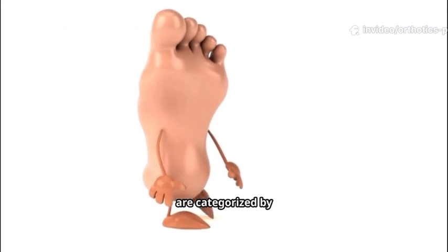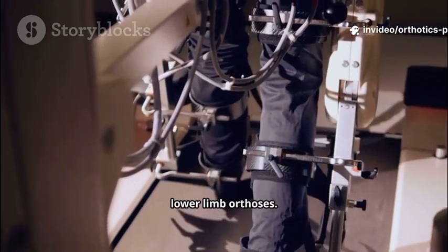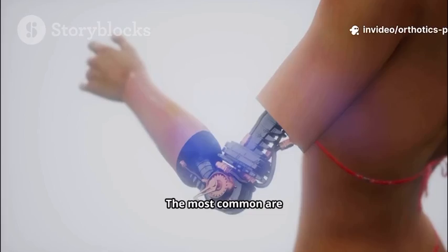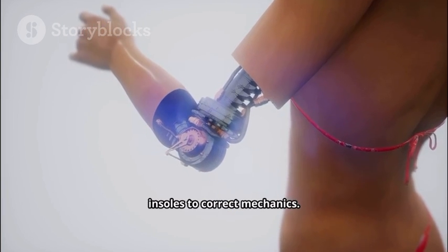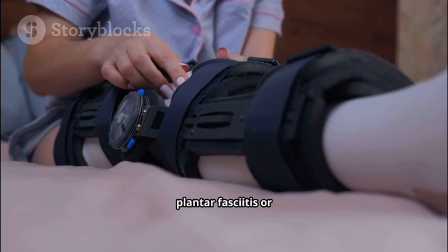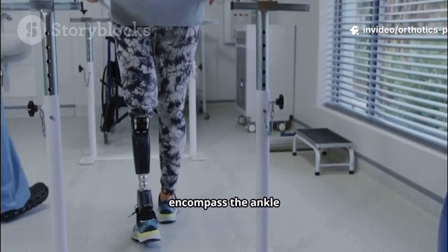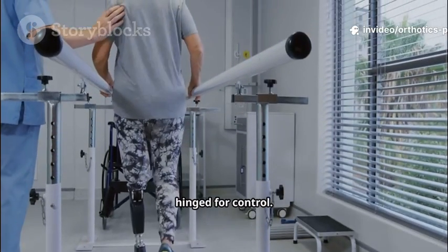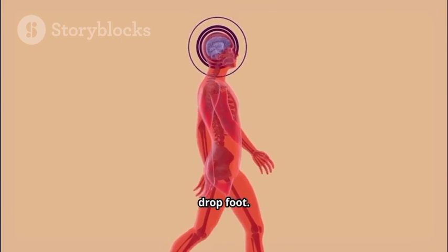Orthotic devices are categorized by the body part they support. Let's start from the ground up with lower limb orthoses. The most common are foot orthoses, or FOs, custom insoles to correct mechanics. They help conditions like plantar fasciitis or flat feet. Ankle-foot orthoses, or AFOs, encompass the ankle and foot, rigid or hinged for control. They're often used to control ankle position, especially with drop foot.